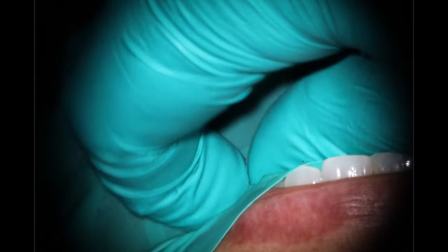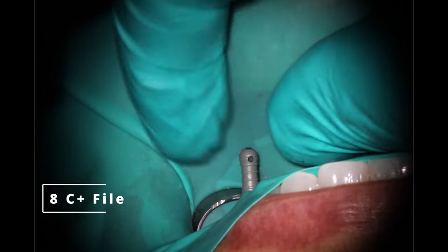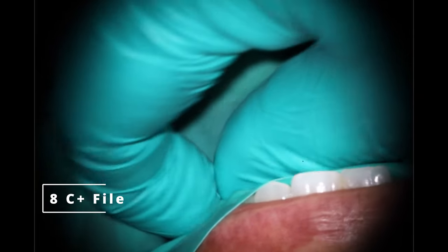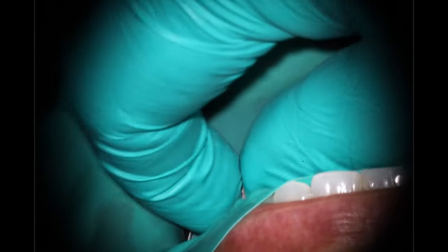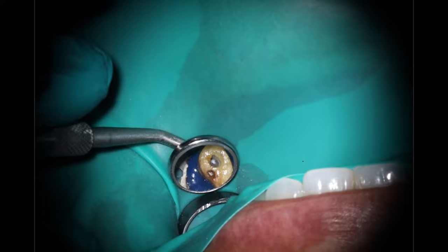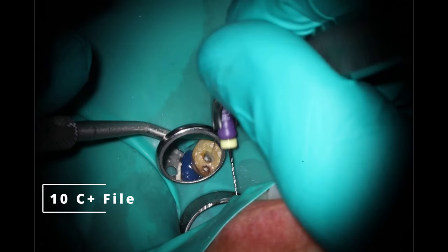What I like to do is work up size 6 through either 10 C-plus, or sometimes I'll go to a 15, to create a little bit more space for my rotary instrument to get inside there and do the work. We're still short of where we need to go, but I'm starting to feel that stick. There's a lot of endo — for as much as we value the microscope and seeing things, so much of this is tactile. What I'm feeling here is a stick, almost like it's gummy. That is a good sign. You get into a problem when you're feeling that you are just running into a solid wall — that's where we have a bad day.